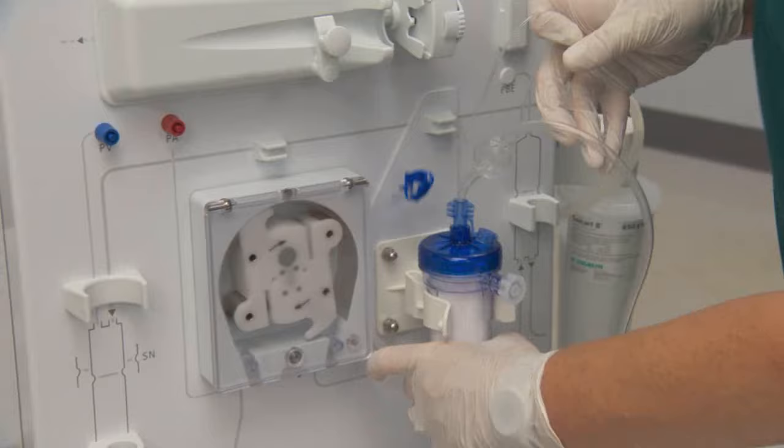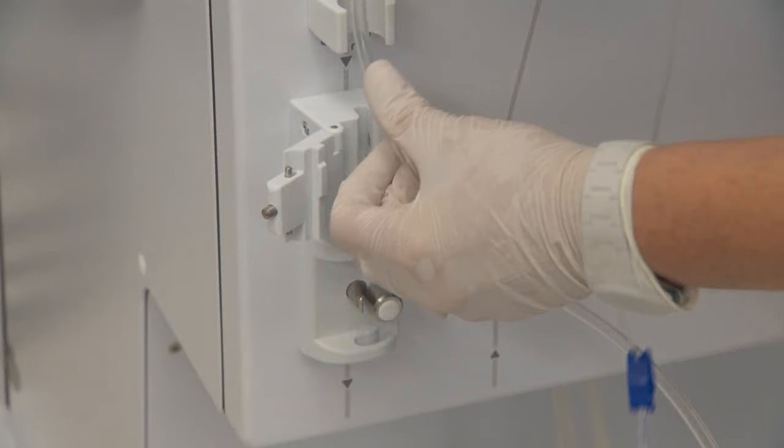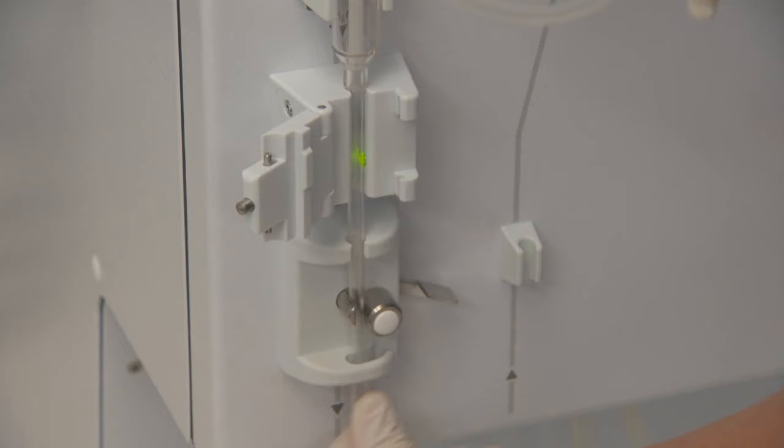Connect the venous pressure monitoring line. Place the venous drip chamber into the holder just above the safety air detector housing, and thread through the air detector and venous tube clamp and clip.